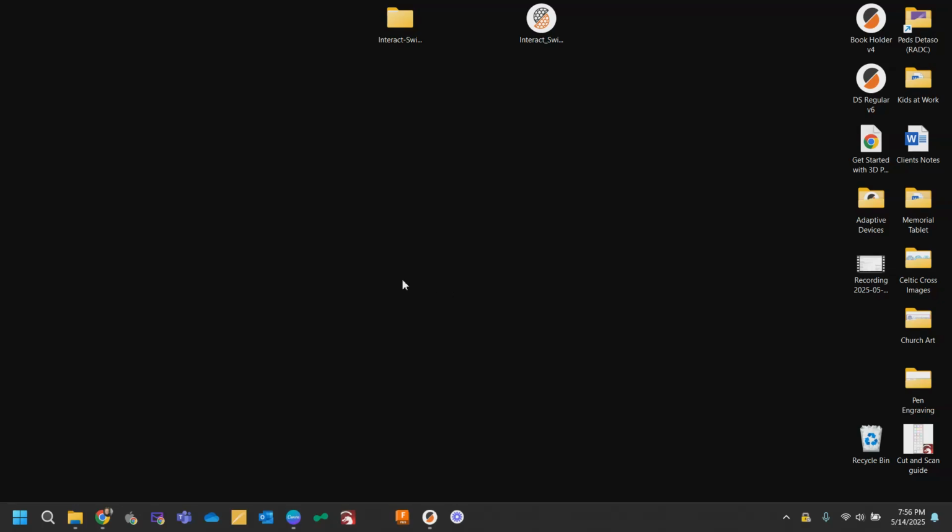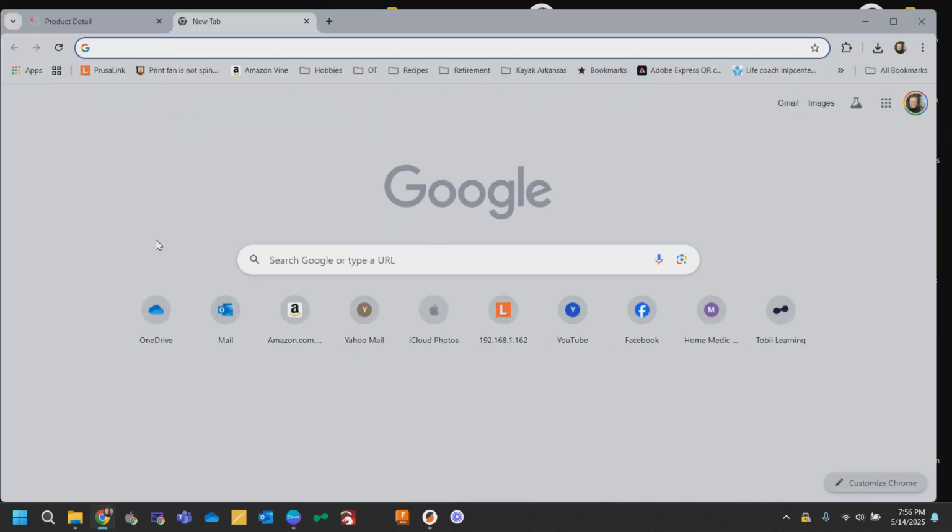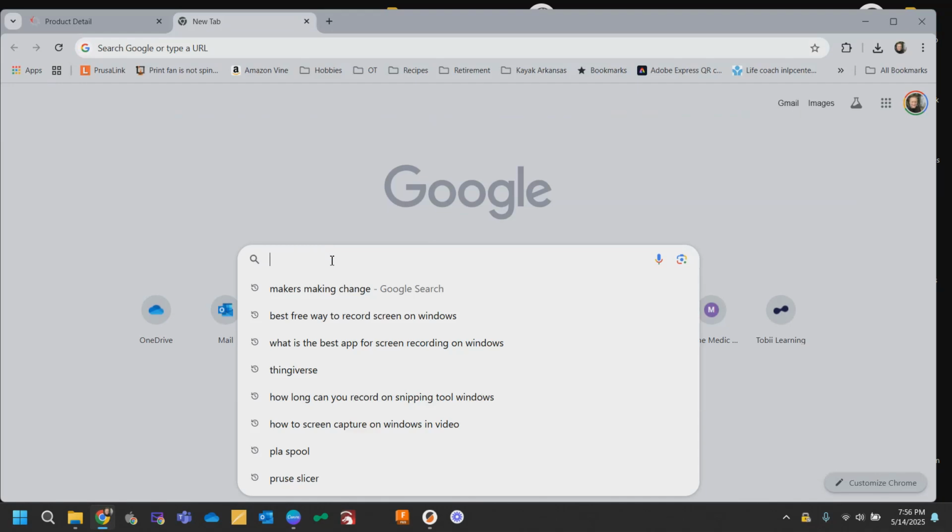Today I'm going to show you how to download a 3D modeling file from the internet and then convert it to a file that your 3D printer can read. We're going to go to Chrome and we're going to pick one of the popular 3D modeling sites. Thingiverse is a very popular one.